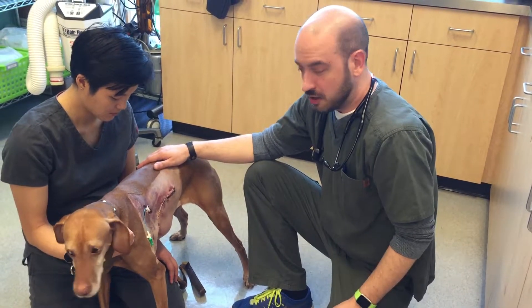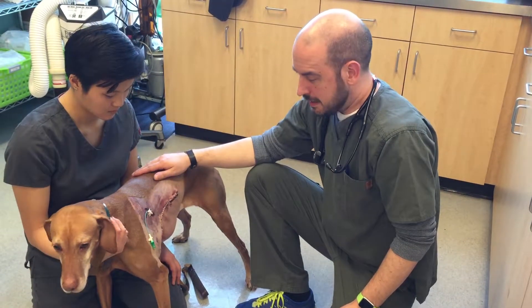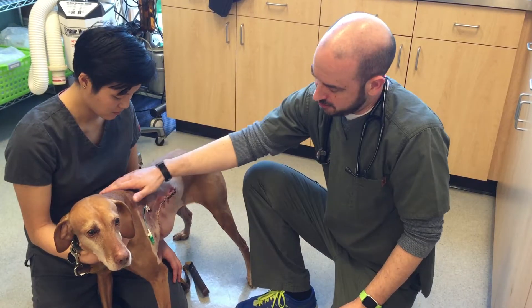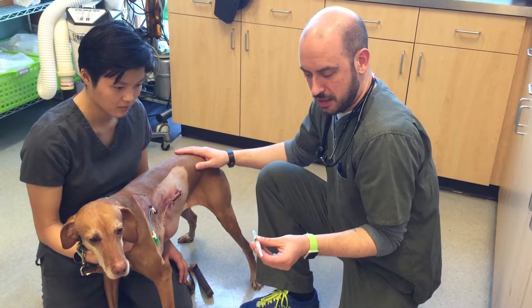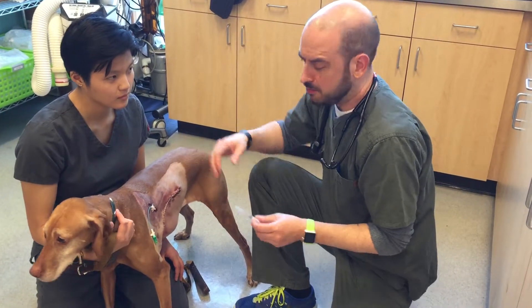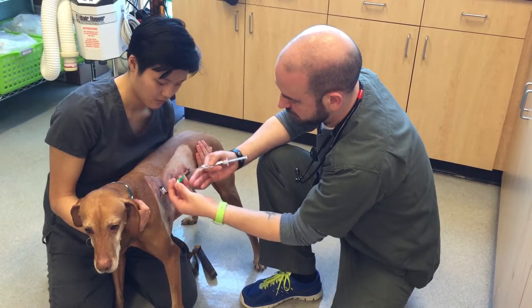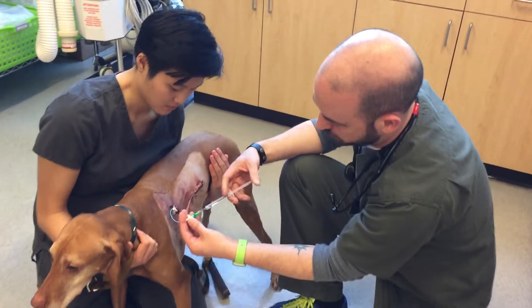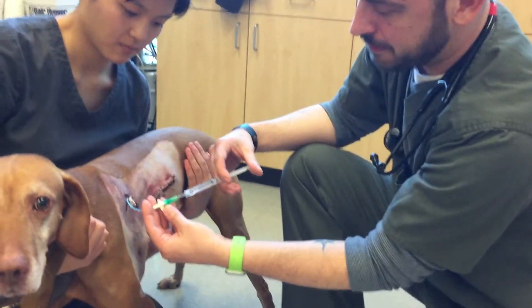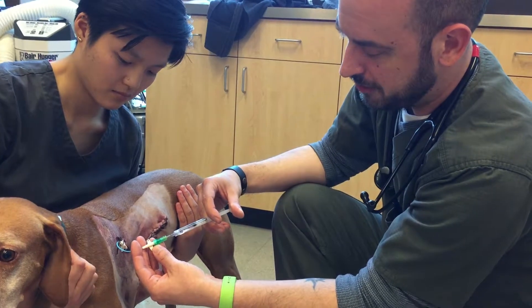What I'm going to do today is give her one final dose and then remove her catheter and send her on her way. As you can see, there's quite a bit of bruising — this was a pretty extensive surgery — so we're going to go ahead and inject about three cc's of bupivacaine. This is very similar to an intravenous injection going right into an IV port, but we're just going to insert the needle and slowly inject her bupivacaine.